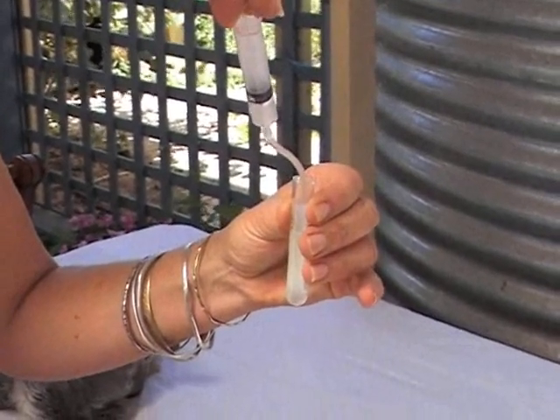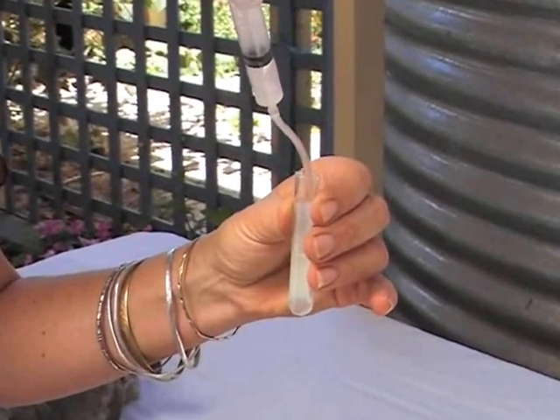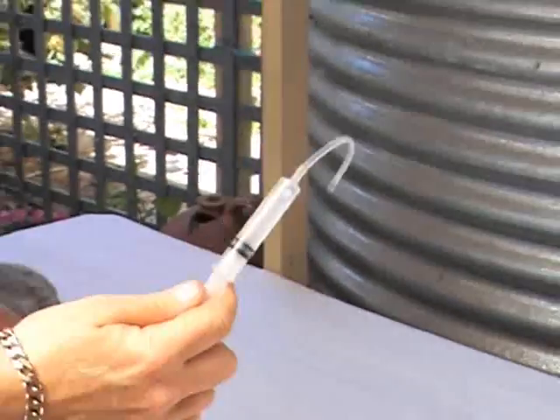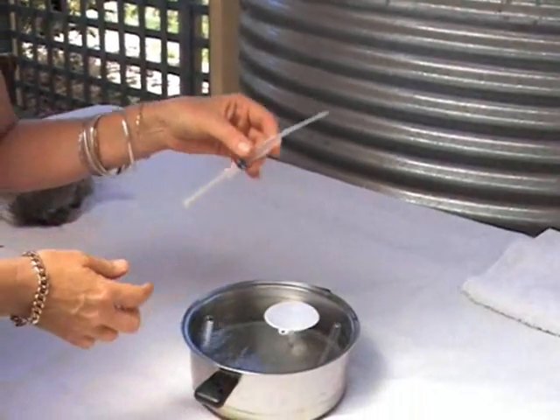We collect it up into the syringe like so. Beautiful — it's all in there. And then we put it back in the water bath, which is still at the same temperature.